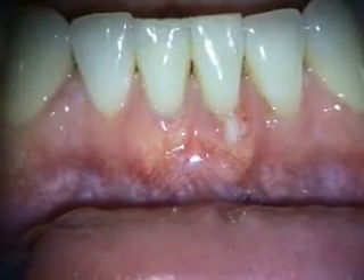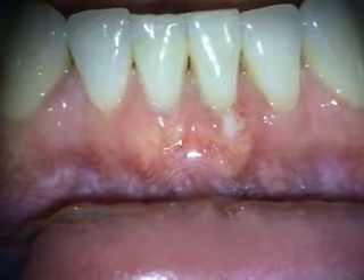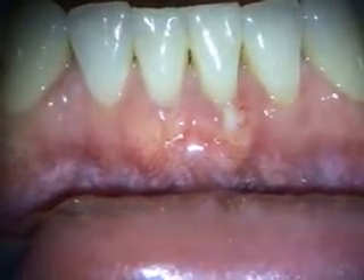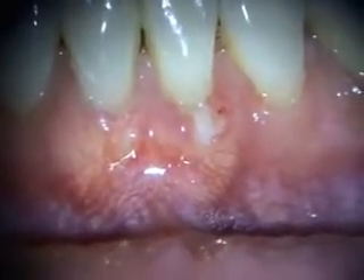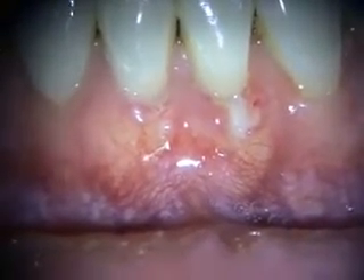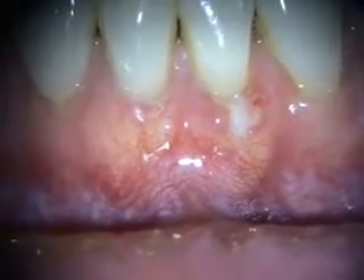This is the two-week healing of the grafting in the 24-25 area. You can see there's a little bit of show of the alloderm on 24, but the soft tissue is really healthy and it's starting to grow over. We're just going to leave it and have him use some chlorhexidine there.